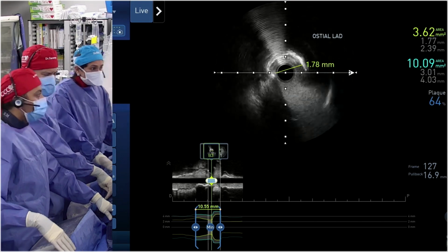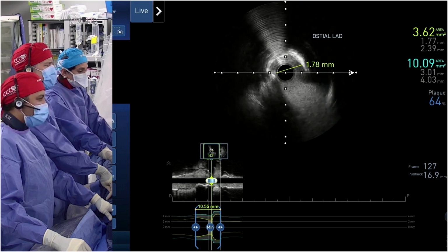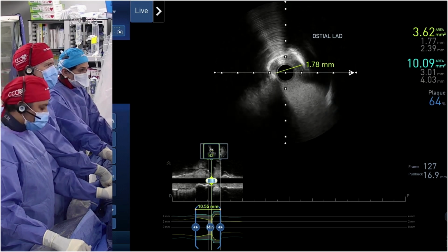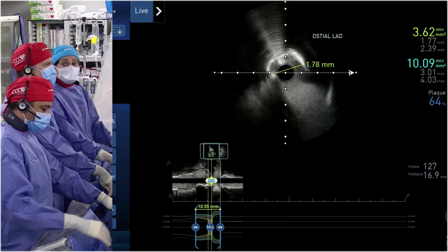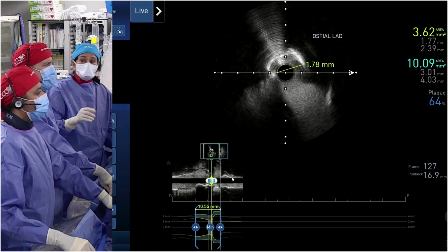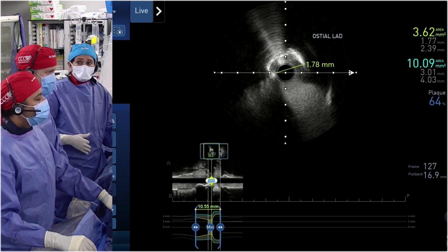So I see the plan of atherectomy. Is it based on your angiographic or IVUS findings? I'm not clear that I'm seeing 360 degrees of arc of calcium. So maybe you can show that imaging to us so that we could be convinced that atherectomy is needed. You can show the IVUS there? Yeah, they are watching it.